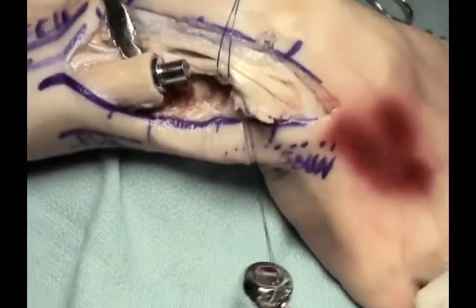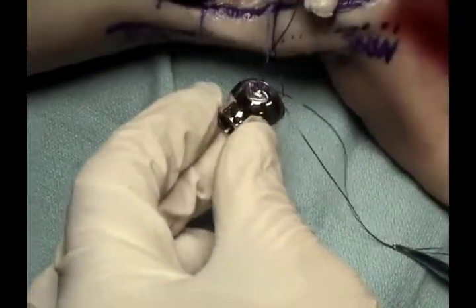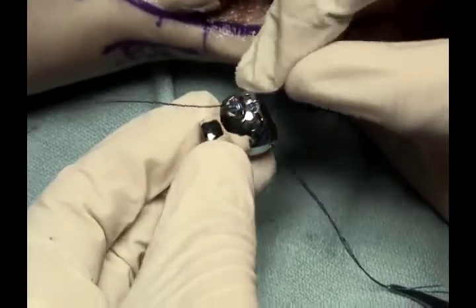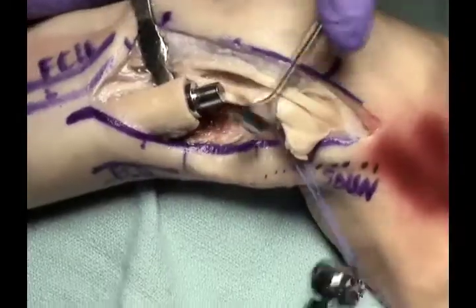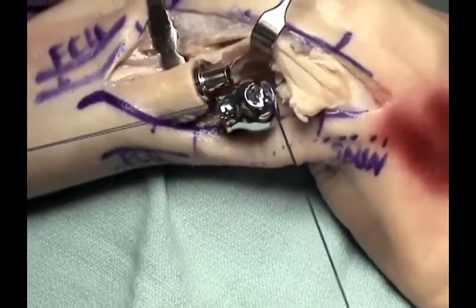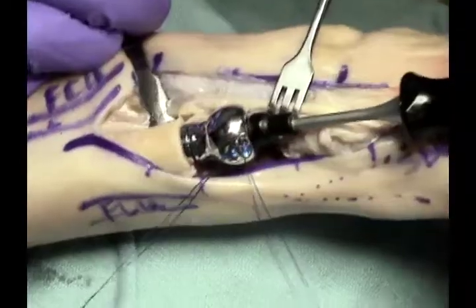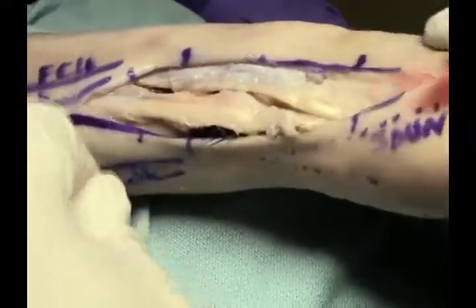Once the sutures are passed and tagged with hemostats, it is then possible to secure the head onto the stem with the correct rotation so that the sutures line up with the triangular fibrocartilage. The head is placed onto the stem and then secured onto the morse taper with an impactor.